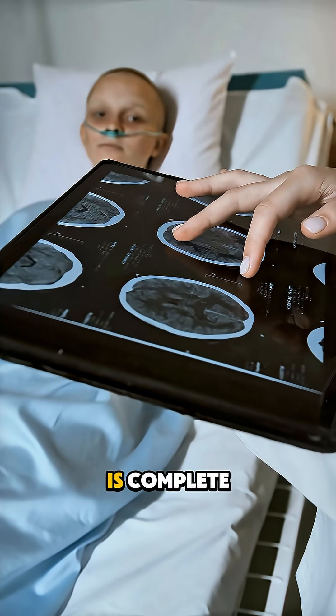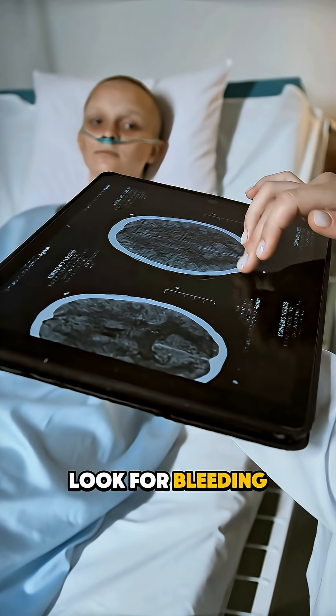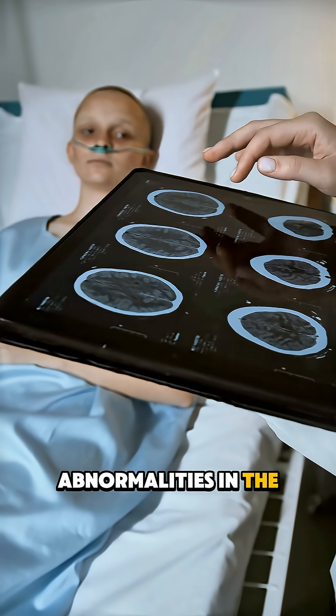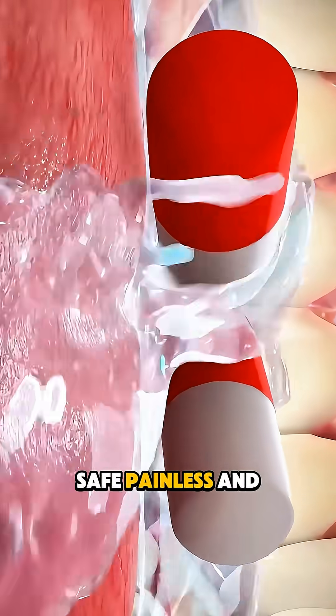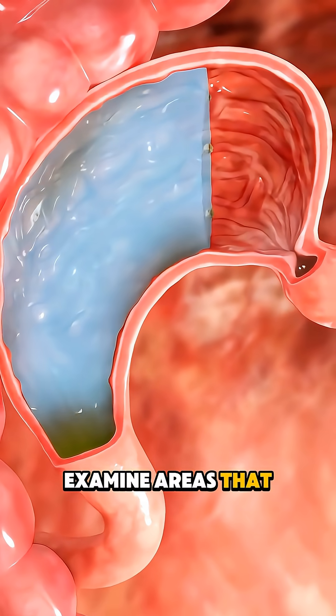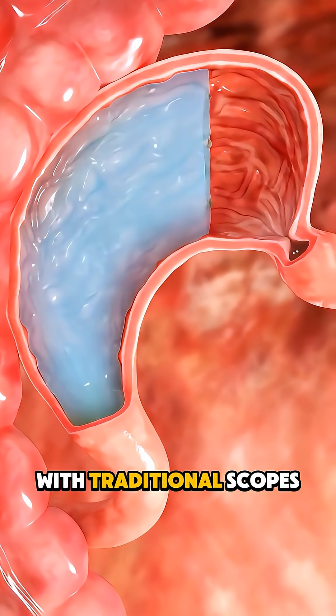Once the recording is complete, your doctor reviews the images to look for bleeding, inflammation, tumors, or other abnormalities in the small intestine. Safe, painless, and detailed, capsule endoscopy allows doctors to examine areas that are hard to reach with traditional scopes.